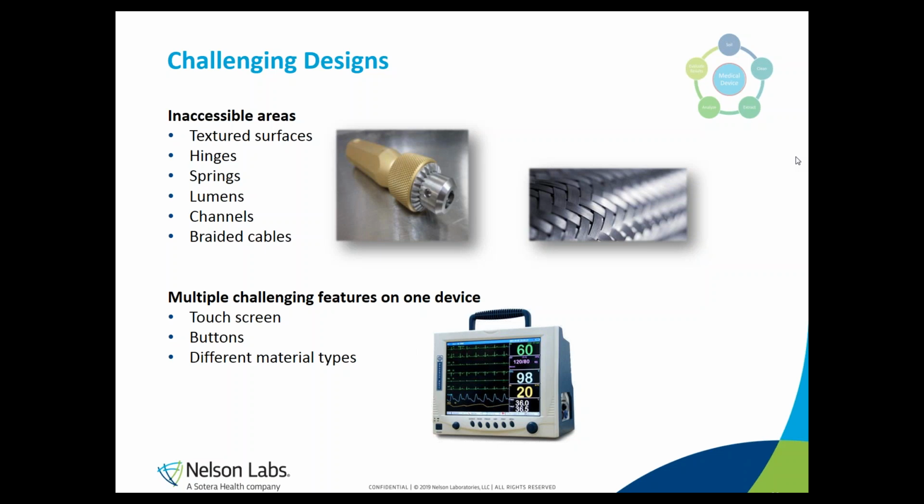Also, any lumens and small pinholes may be difficult to reach during a cleaning procedure, which makes them also very challenging to get cleaned properly. And sometimes multiple challenging features are even present on one device at once. For example, this monitor on the slide. We have here a handle with a structured surface, different types of buttons, and also multiple material types. So when designing new devices, it is always worth keeping these features in mind, as they can cause problems in a later stage when processing procedures need to be validated.